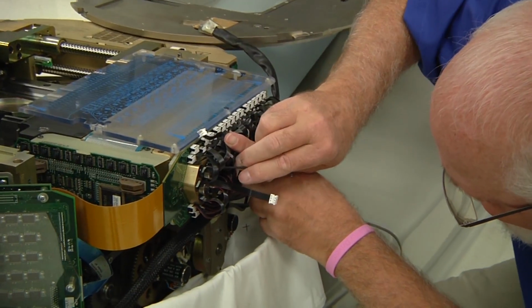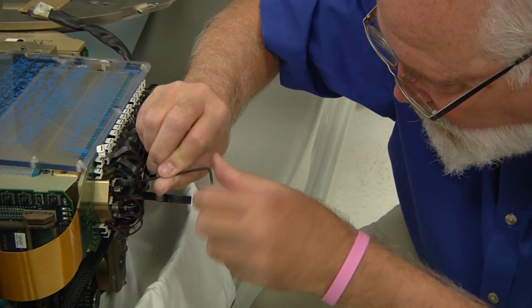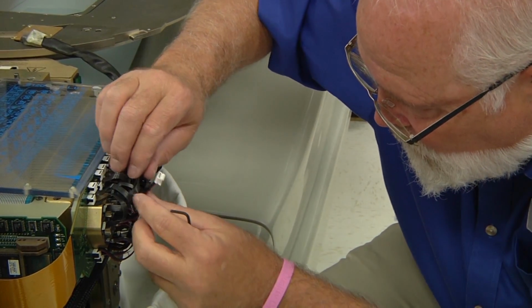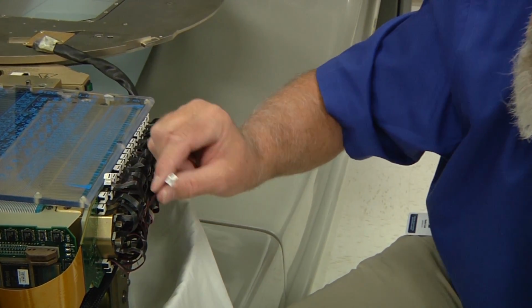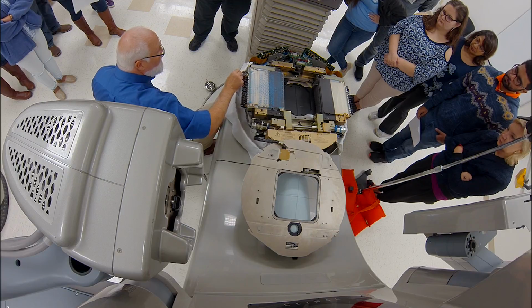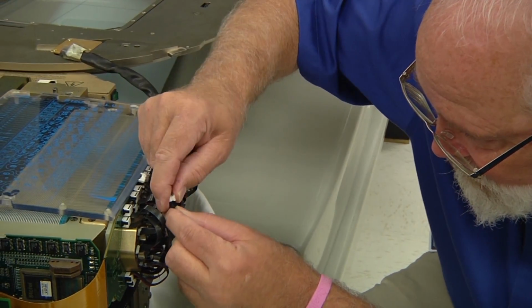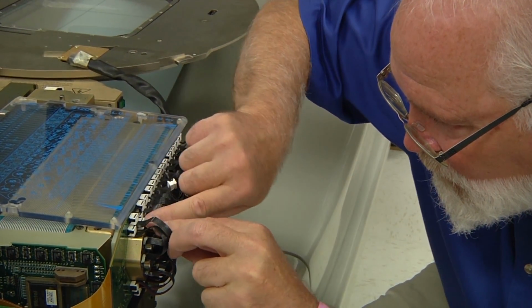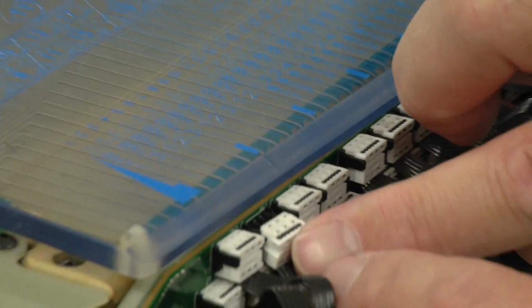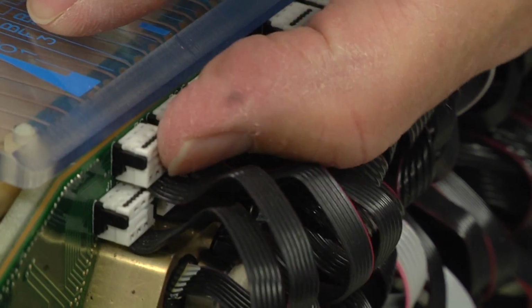Again, I want to check to make sure it's springy. So it may not always line up with the connector right away. This one I need to turn it slightly, so just go ahead and bend the cable into position. And these are keyed. It only goes in one way. Okay, so they're all connected.